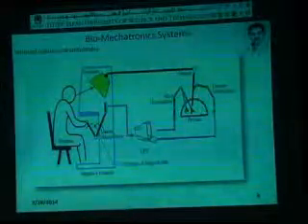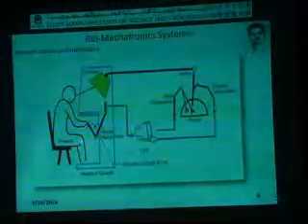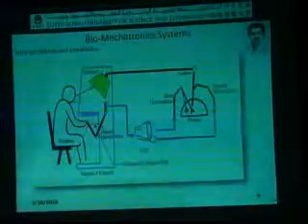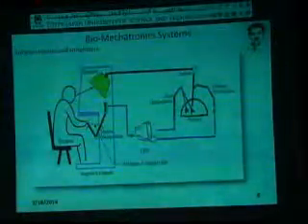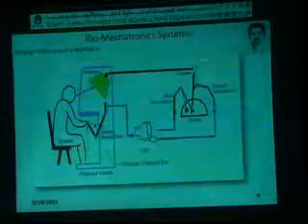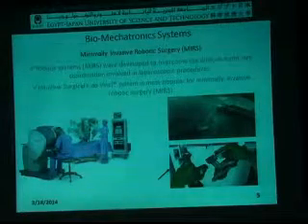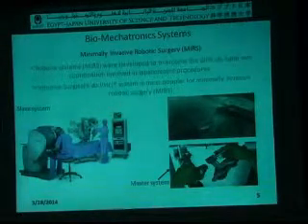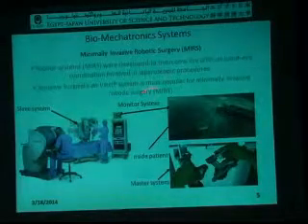Our lab, biomechatronic system, developed such a teleoperation system. Usually, minimally invasive surgery consists of a master manipulator, or master robot, controlled by a surgeon, and a slave unit inside the abdominal wall of the patient. The surgeon can see inside the abdominal wall by some kind of camera and display unit here. The most famous device, maybe the only device, is the da Vinci. Here you can observe the master unit, and the slave unit is here, dealing inside the patient, and the monitor system is here.